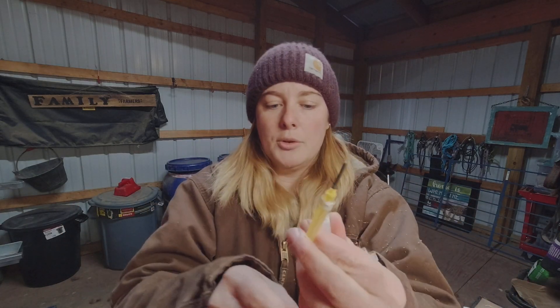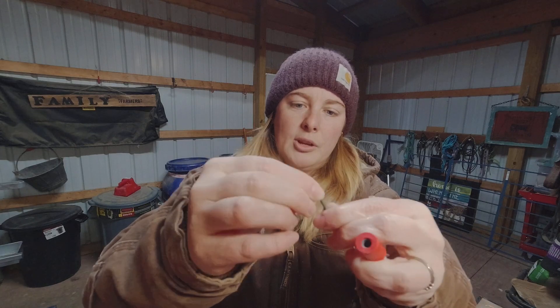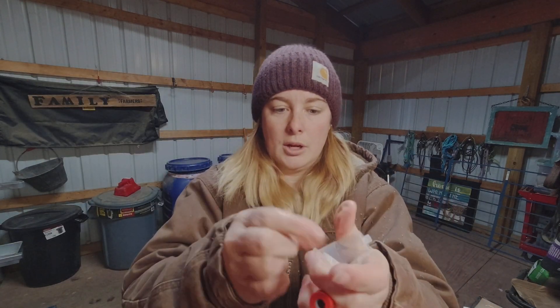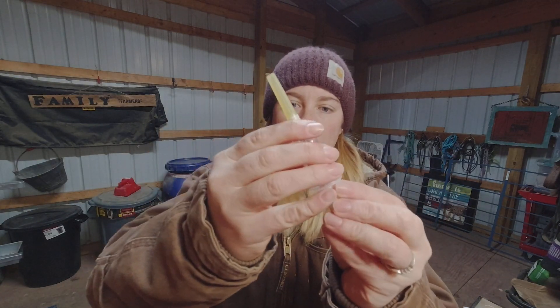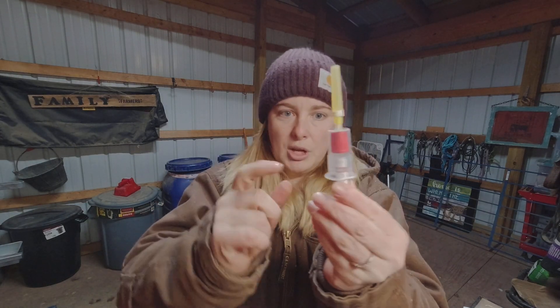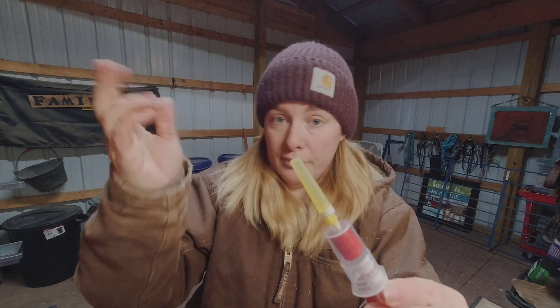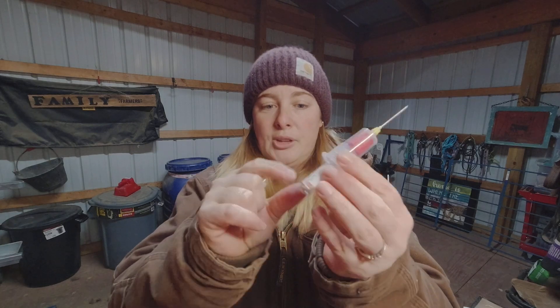With the double-sided needle system, one end goes down into the red top tube, but you'll notice it has a little rubber sleeve that you pull off before screwing the needle into your holder. When you're ready to draw blood on the goat, gently insert the red top tube into the top of the holder — don't push it all the way down — as this helps create suction when you push the tube up. Once you've found your jugular vein, remove the cap and guide the needle in. Blood will start flowing down into your vial. I prefer the syringe method and transfer blood into the red top tube afterward.